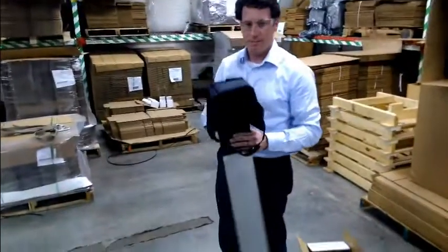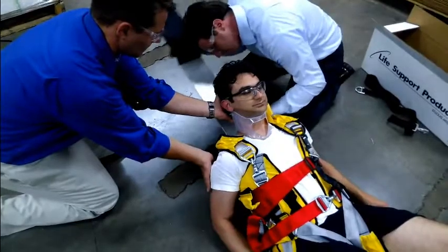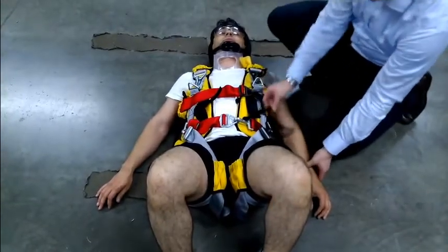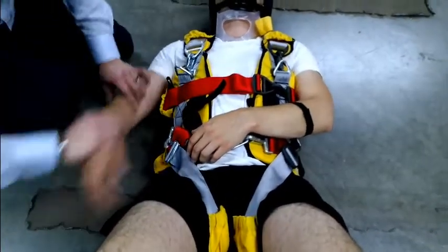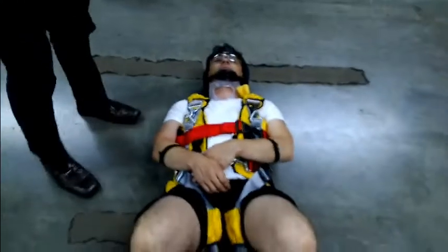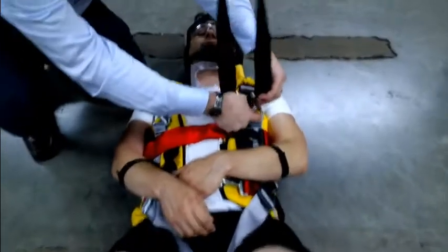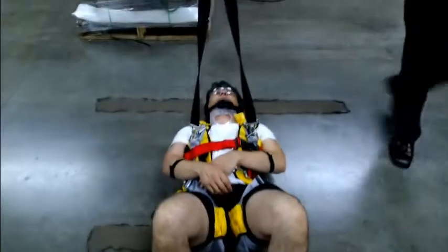Once the leg loops are tightened, attach the head harness and spine immobilizer. The backstay is then slid into the pocket in the back of the vest and secured using the Velcro straps. Once the head harness is attached and tightened, immobilize the arms using the thin Velcro straps on the side of the torso so they don't come loose during the vertical lift. Then use the two D-rings in the middle of the chest to attach the vertical lift strap.